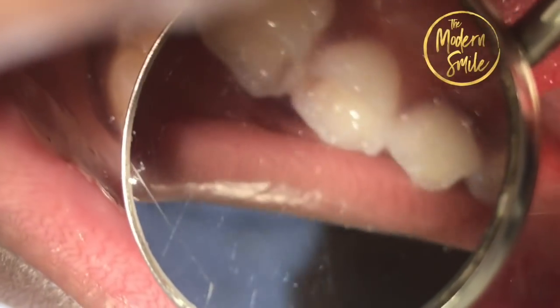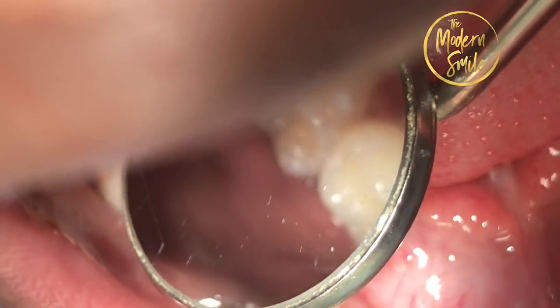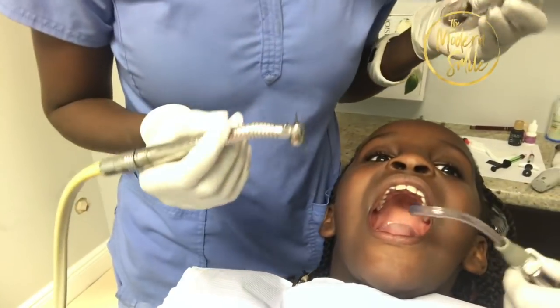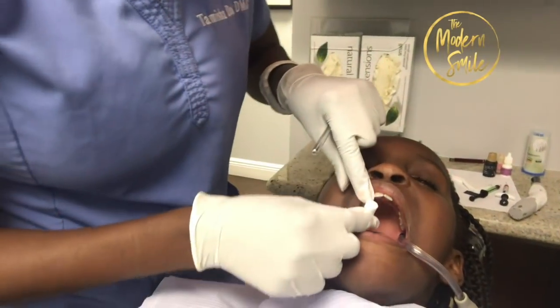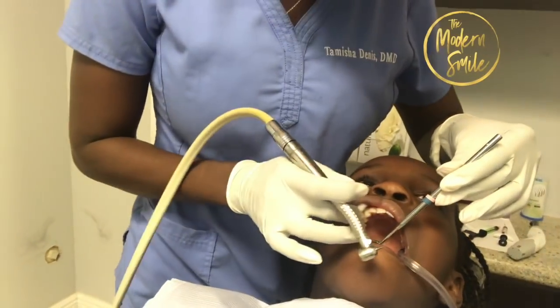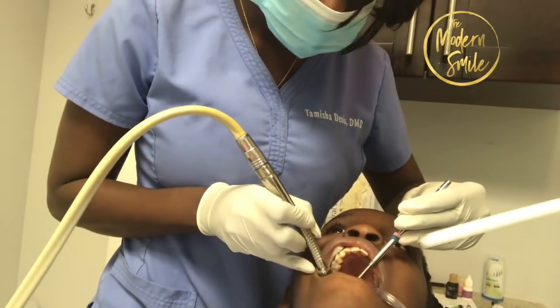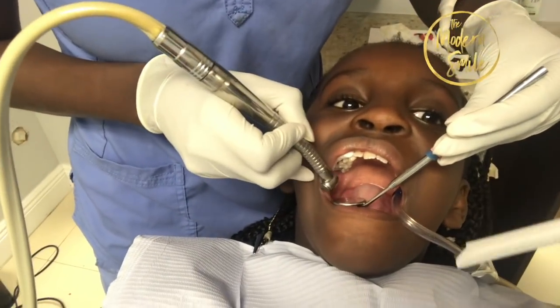And Genesis, was that hurting you? No, not that much. So even though we had started the rest of her mouth fillings, today was the day we were going to complete them. So you're going to see me first drill out the two brown spots of the teeth. And Genesis, when you were having all of that stuff in your mouth, were you nervous at all? No, because I did it before. So you did it before, so it wasn't as nerve-wracking, right? No.